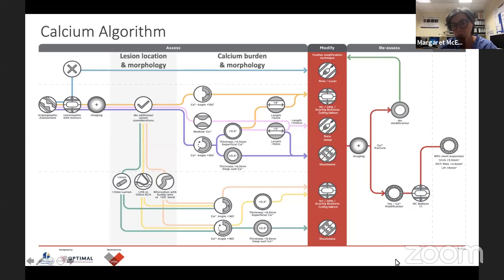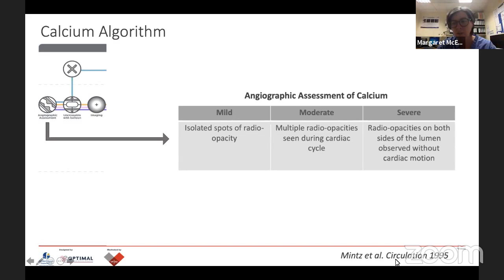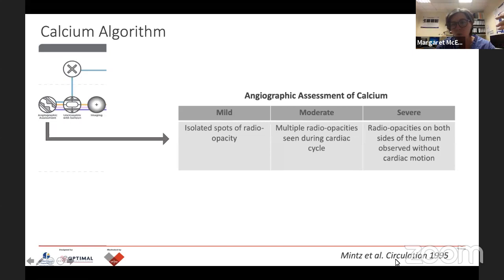I'm going to take you through this step by step and show you two or three cases to illustrate how we use this in everyday practice in the lab here. Like with everything, you start with your angiographic assessment. And if we go back 25 years, Gary Mintz defined coronary calcium on angiography as you see here. Mild calcium is isolated spots of radio-opacity on the angiography. Once you start to see multiple radio-opacities during cardiac motion, that becomes moderate calcium. And once you see radio-opacities on both sides of the vessel when the heart is still on fluoroscopy, that's defined as severe calcium. That's quite a nice, simple way to think about it.